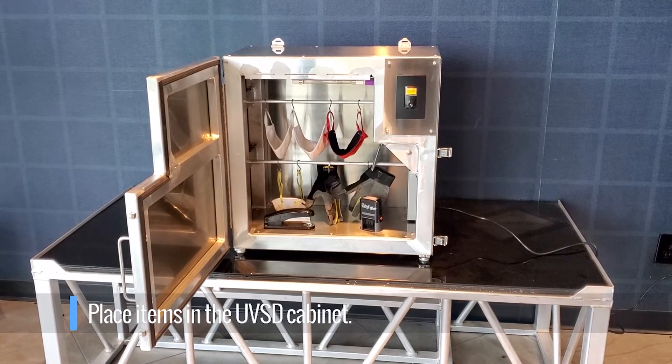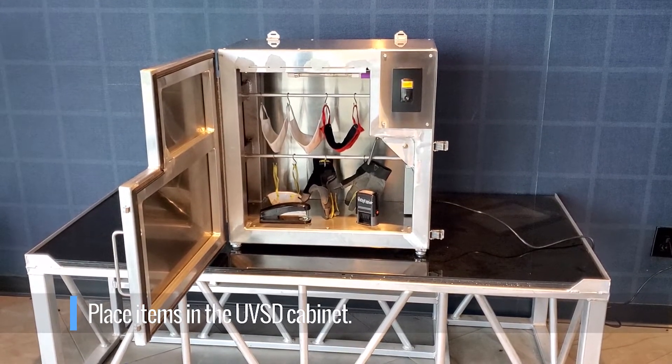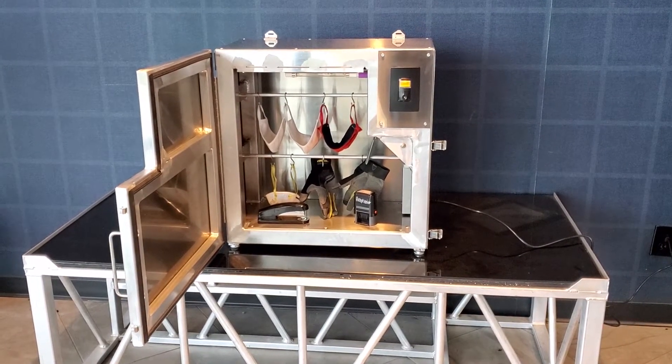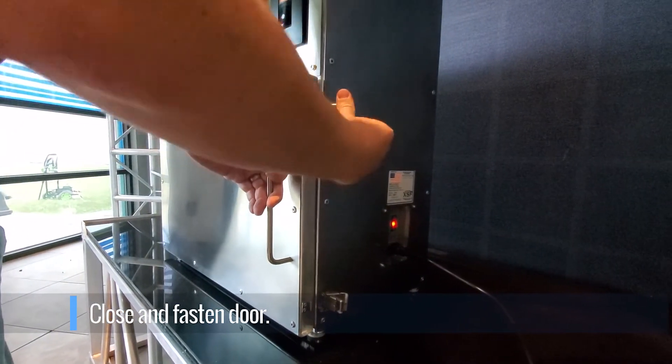Place, lay, or hang any items you wish to disinfect into the cabinet. Once the cabinet is loaded, close the door and securely fasten the two latches.